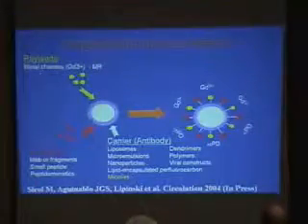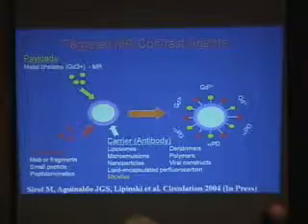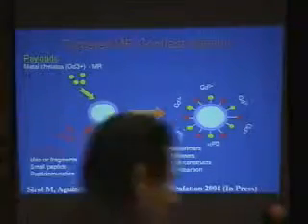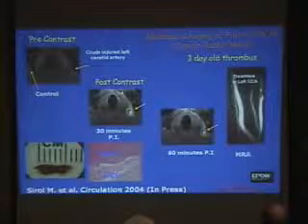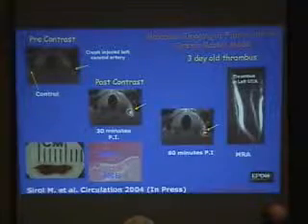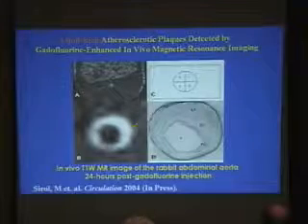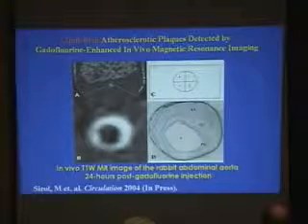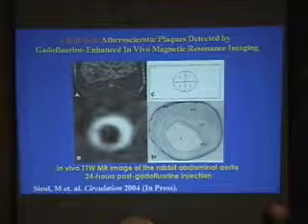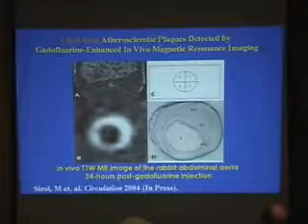The most interesting thing is the molecular MR. Now we are able to see a single clot of 1.5 millimeters with MR by targeting the MR with specific antibodies. For example, this is just a 1.5 millimeter clot here. This is in the rabbit model. But also the fat. Look how beautiful. In other words, what I'm really seeing here is that molecular MR is going to provide incredible information, not only at the molecular level, but on the diagnostic level from the point of view of tissue characterization. And that's the way we are doing.